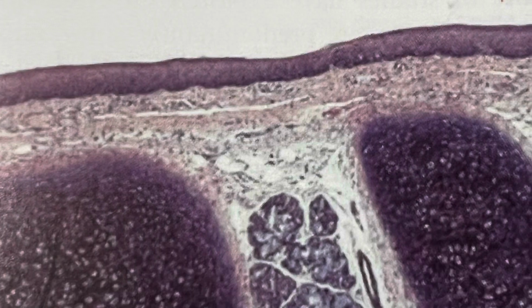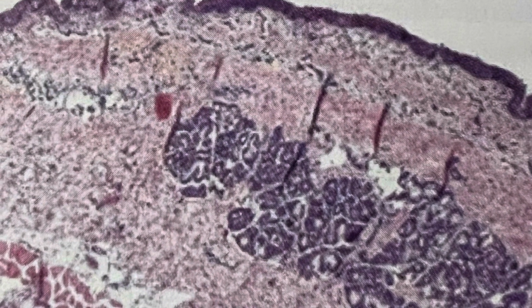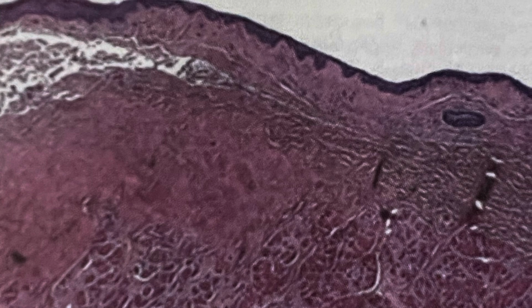To assess the potential value of OCT imaging technology in improving visualization of pathology, as well as the diagnosis and treatment of a given organ system, it is essential to first image normal tissue from the particular organ, then reference this OCT imaging to parallel histology. OCT is useful in oral cavity lesions, tongue lesions, and laryngeal lesions like polyp, nodule and carcinoma in situ. All these lesions can be detected by OCT without histology.